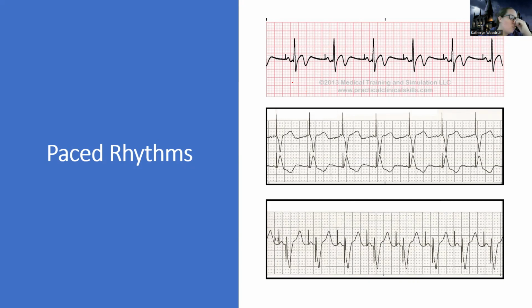You also need to know what you're expecting if we had a question where we just described it. For paced rhythms, I didn't talk about this with pacemakers, but you can be paced for your P wave or your atria, or you can be paced for your ventricle, or you can be paced for both.